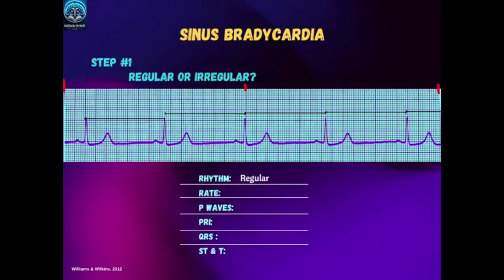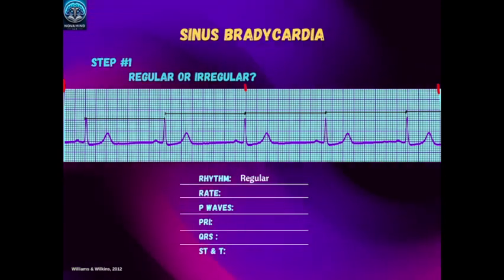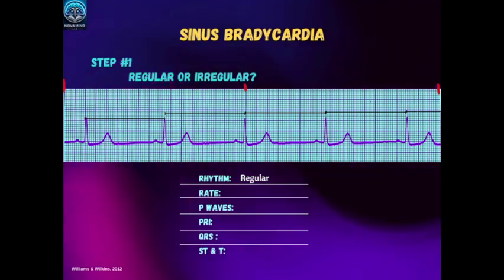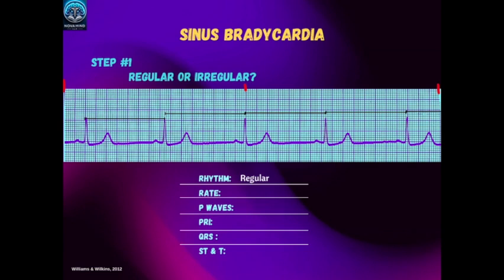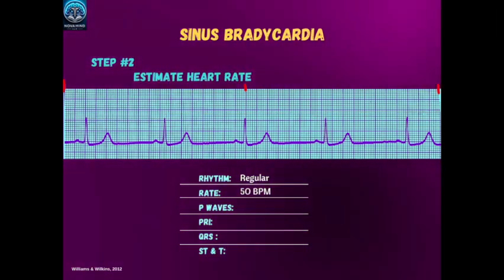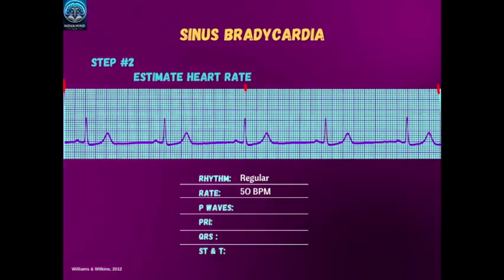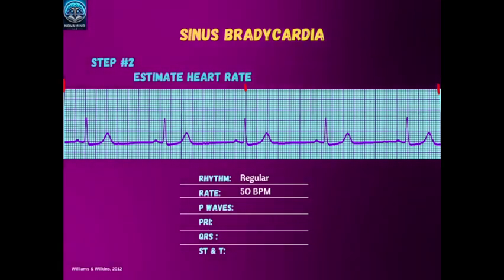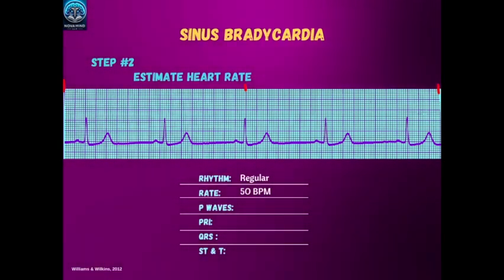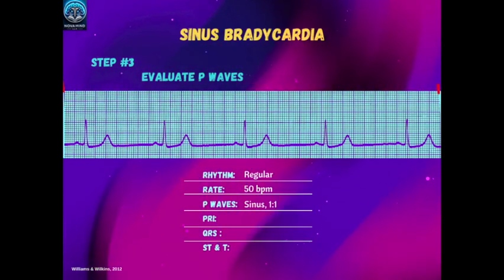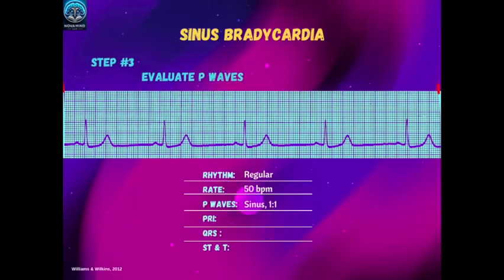Now let's do a practice strip for sinus bradycardia. Step 1: the rhythm is regular — counting small boxes between R-to-R intervals gives an average of 37 small boxes, and using the hash mark method confirms the rhythm marches out regularly. Step 2: I notice three red hash marks indicating a six-second strip. Counting R waves, I have five within the six-second strip. Five times 10 equals 50 — the estimated heart rate is 50 beats per minute. Step 3: evaluating the P waves, there is one P wave for every QRS, and each P wave is upright, round, and uniform — confirming sinus P waves.